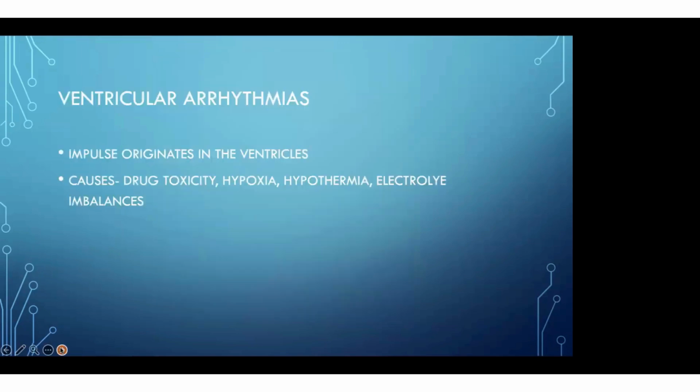So now we are going to ventricular arrhythmias. Till now we've seen narrow QRS tachycardias. From atrial premature contractions to some atrial arrhythmias, we have seen atrial tachycardia, atrial fibrillation, and atrial flutter, which can cause decompensation if the ventricular rate is high. If the ventricular rate is controlled, they will tolerate it and only have some symptoms. If they are not tolerating, then you have to cardiovert them or give amiodarone.